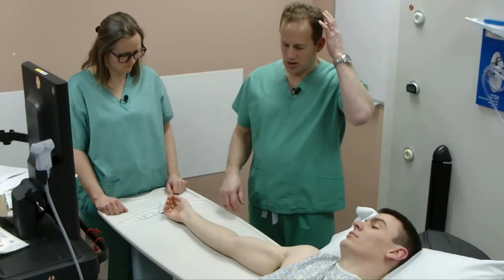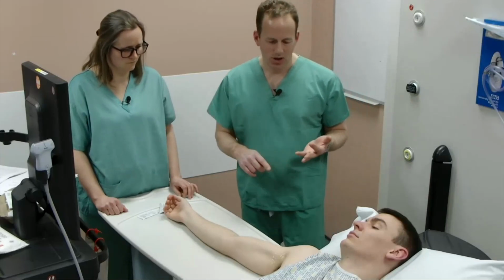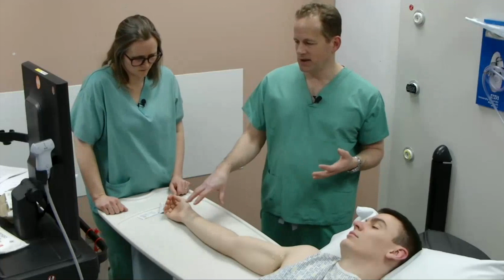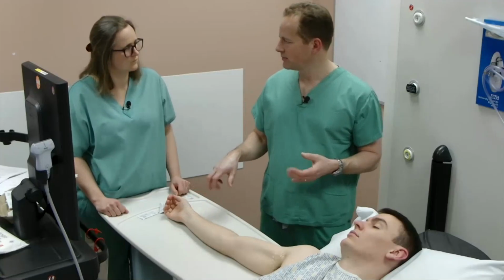And then you've got time, because there's invariably all the checks, the who and positioning and all the rest of it, waiting for surgeons, etc. So there's generally time for the rest of the block to cook. And I've done distals, so I would have done my distal blocks as well. So they will have covered the operative site. So I'm not really too worried.